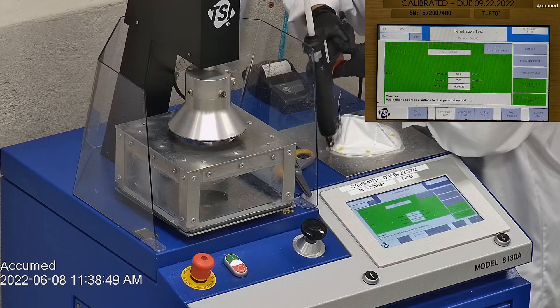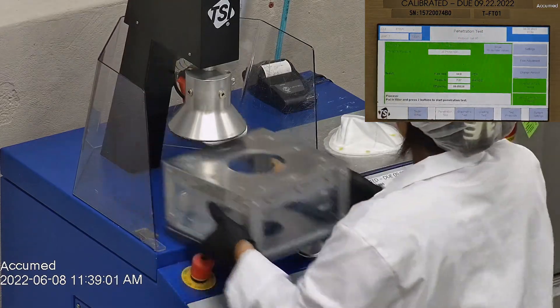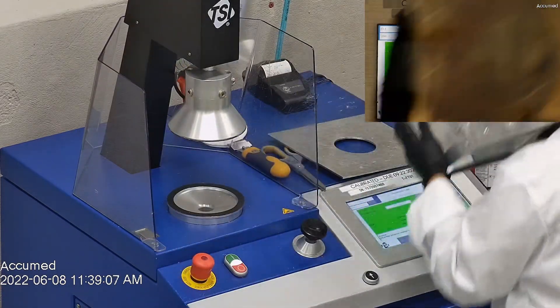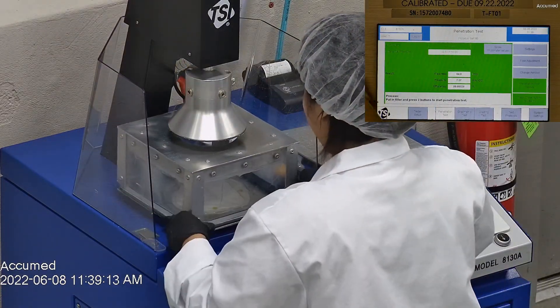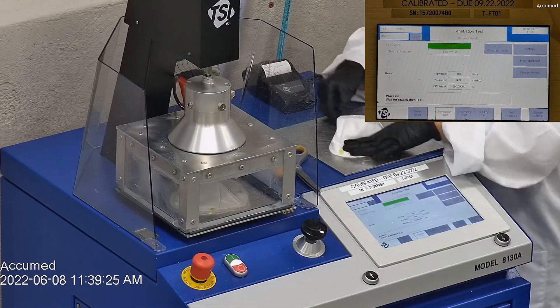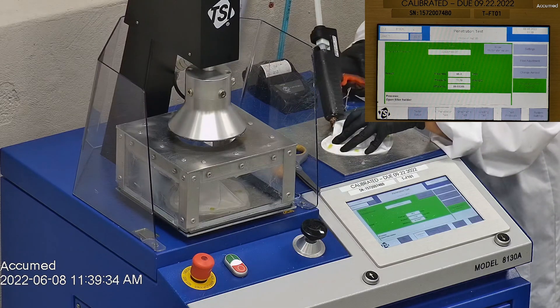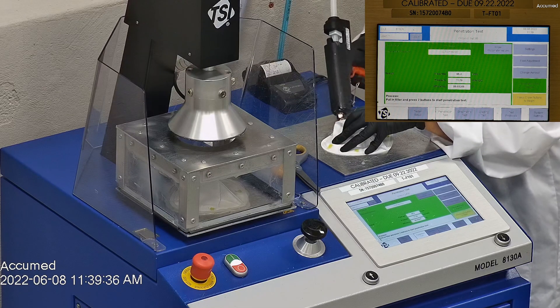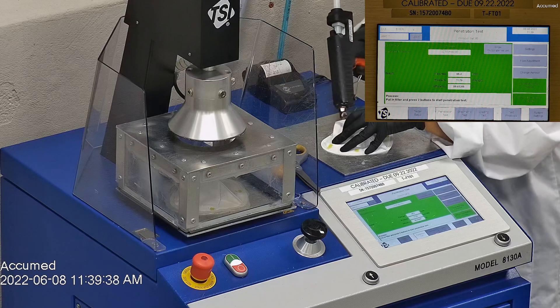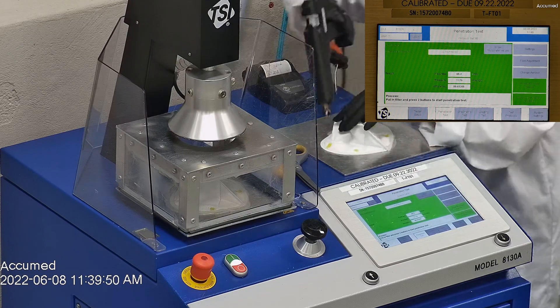The results are displayed on a TSI monitor. F stands for air flow rate, which we test at 85 liters per minute. R is for resistance, also referred to as pressure drop, which correlates with breathability — so the lower the number, the more comfortable and breathable the mask is. E stands for filtration efficiency percentage.